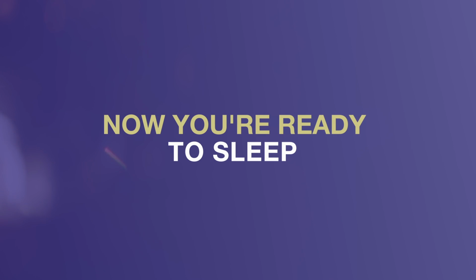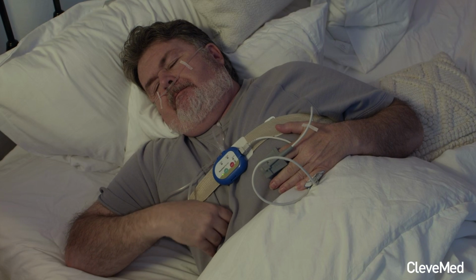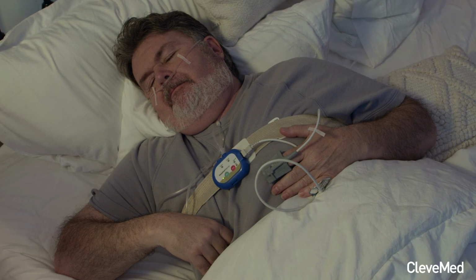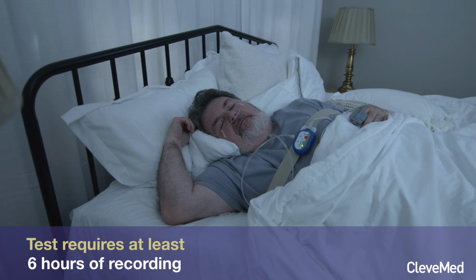Now, you're ready to sleep. Find a sleeping position most comfortable for you to ensure a strong recording signal. Try to spend some time on your back, as sleep apnea can be worse in that position. The test requires at least 6 hours of recording.